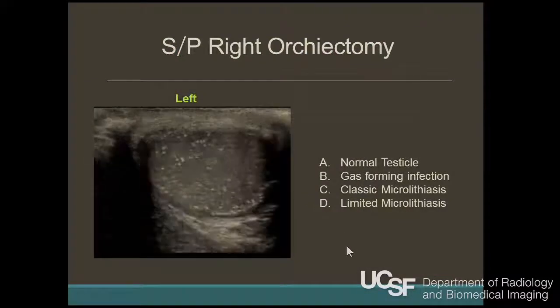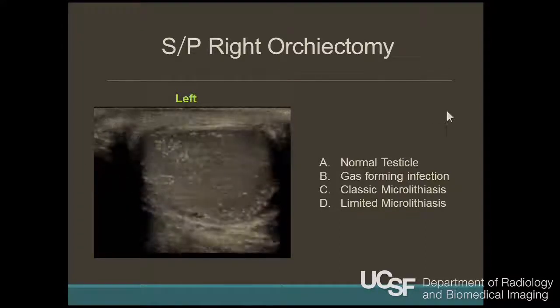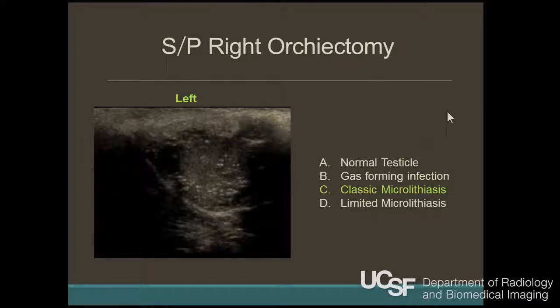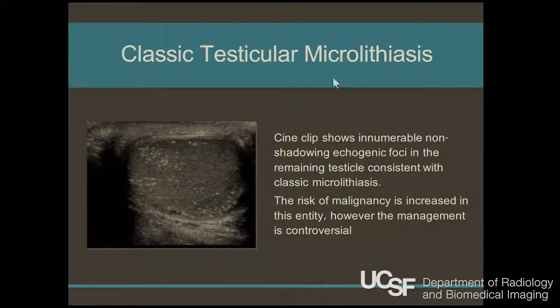Okay, next case. Person had a right orchiectomy. This is their left side. And this is microlithiasis. We call it classic microlithiasis. So this is what we call classic testicular microlithiasis.